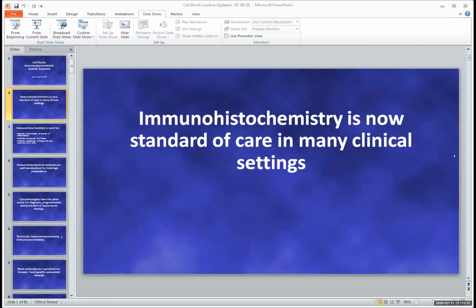Now, immunohistochemistry is now really the standard of care in many clinical situations for the workup, diagnostically and prognostically, for a wide variety of lesions. Immunohistochemistry is a very, very well-known technique with which we have decades of experience. With what the fixation protocols are, how specimens should be prepared, and we all have large libraries of positive controls that we can use to ensure that our staining is appropriate and specific.